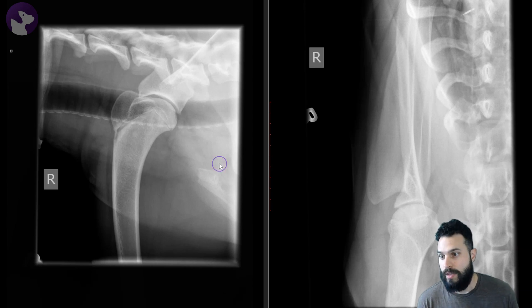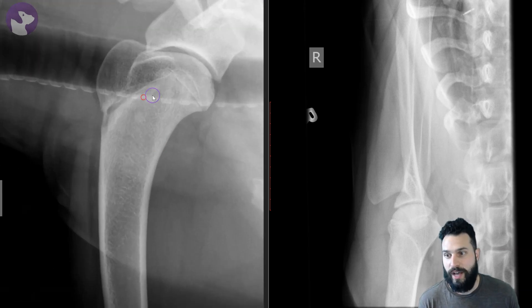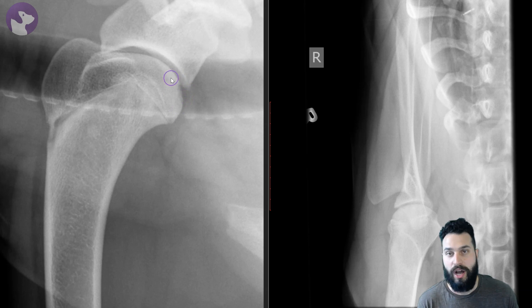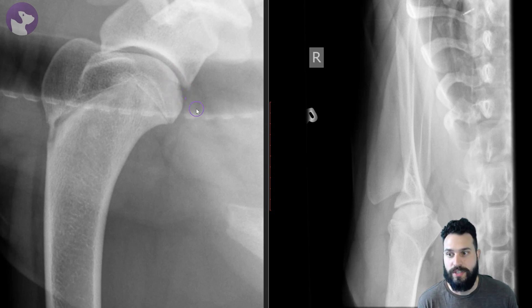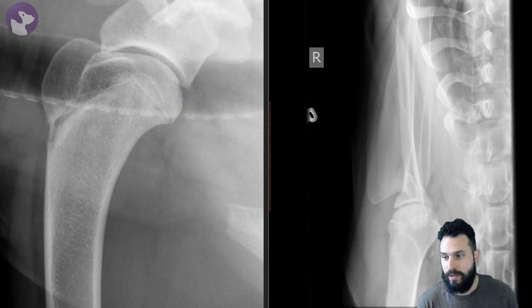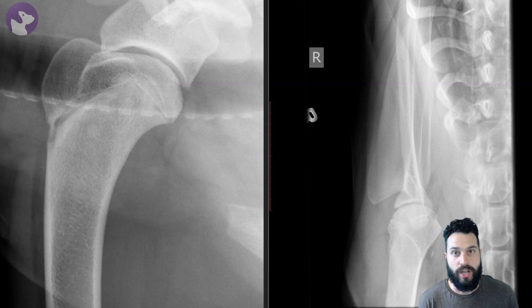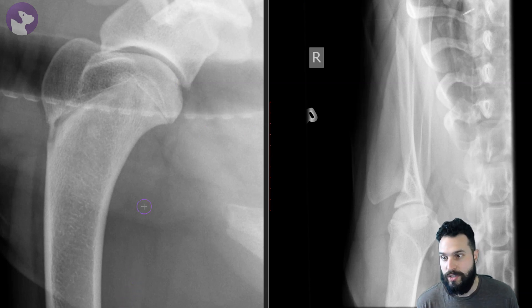The lateral projection is going to be our most valuable in this instance. What we're looking at here is the caudal aspect of the humeral head — this is zooming in right on where this lesion is. One of the nice things is that we've positioned this over top of the trachea to highlight this lesion. This is an OCD lesion: a concave defect in the caudal aspect of the humeral head, which is what's causing the lameness in this patient.